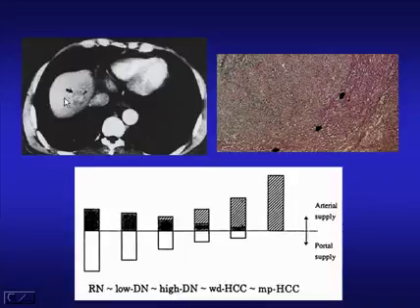And this is due to a fundamental property of the liver with its dual arterial and portal venous blood supply, and the transformation of normal liver tissue to tumor tissue involves the progressive switching of blood supply into the pure arterial phase and away from portal venous supply.